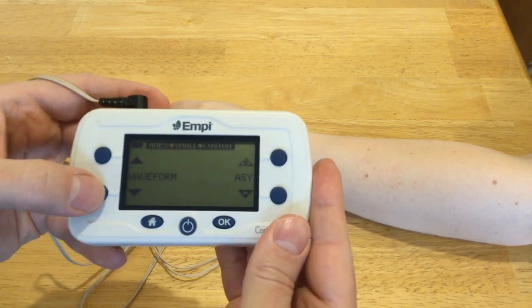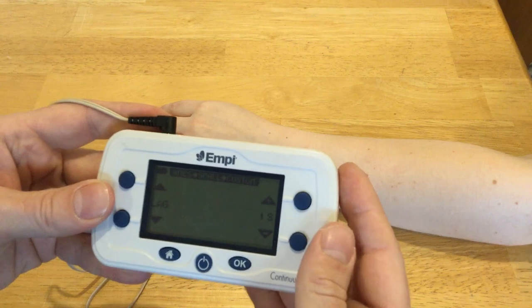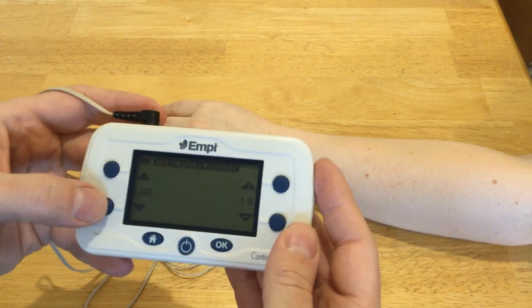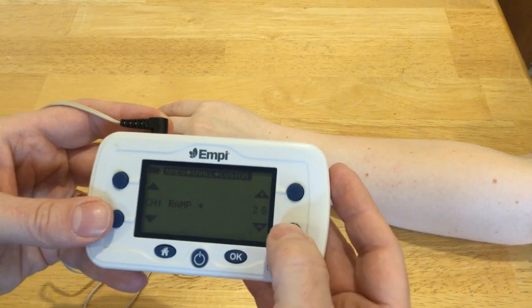Continuing through the settings: lag has to do with if you're using two sets of electrodes — I'm not, so that setting doesn't really matter. Ramp up means how long is it going to take to ramp up; right now it's set for two seconds.